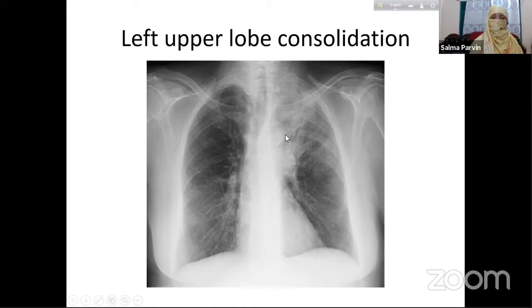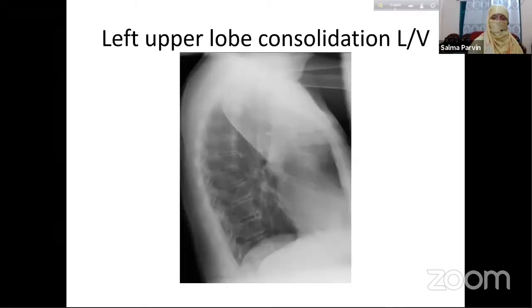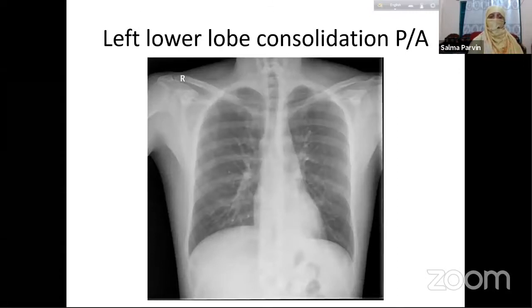This is a chest X-ray of an old patient, old lady, and again the question of any malignant transformation is to be kept in mind. This is a chest X-ray seen here. Both the lung fields are clear. You see, nothing is seen except the cardiac shadow and the valve shadow. The costophrenic angles on both sides are seen very nicely, acute, terminated at the right lateral and left lateral chest wall.